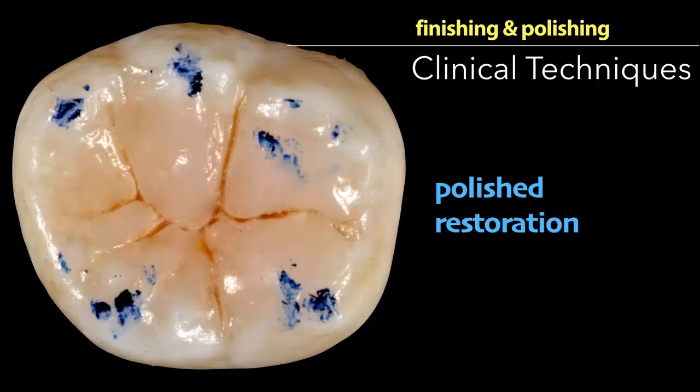And about the tints, 90% of cases have stained fissures. So we apply the tints here to make that molar look as natural as a human dentition. Yes, in a few cases you don't see stained fissures, but in 90% of cases there are. We have done a lot of molars in clinical practice, and every molar is stained except a few.